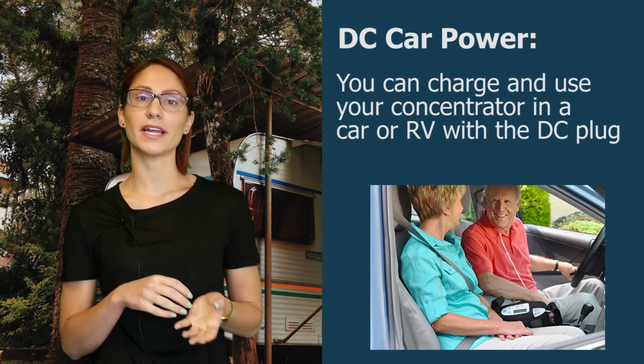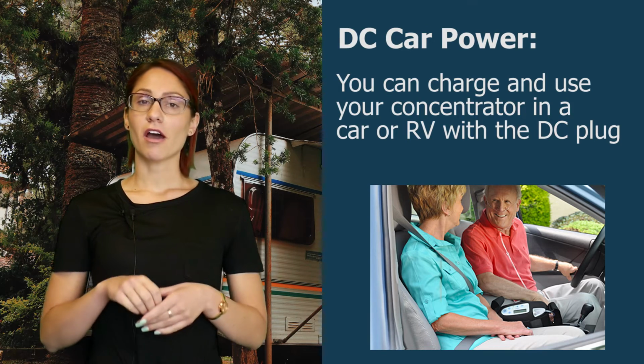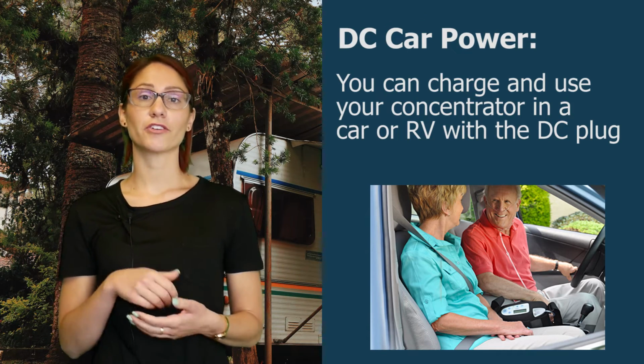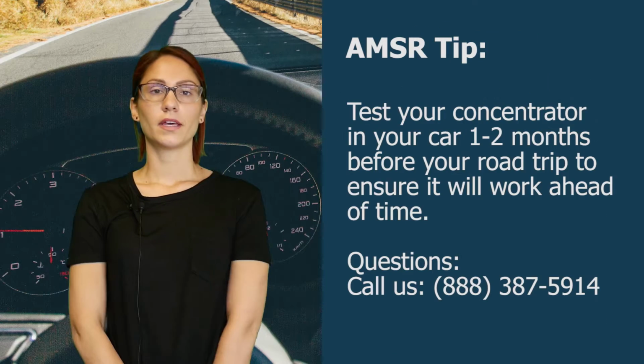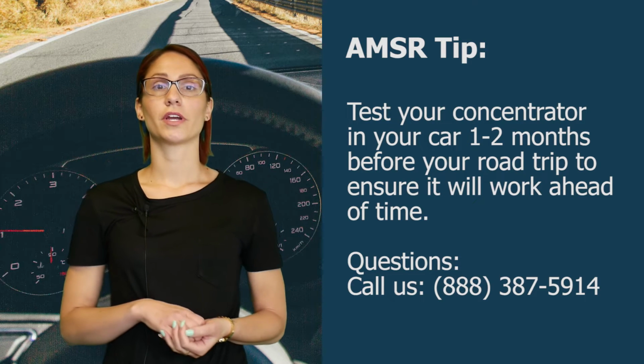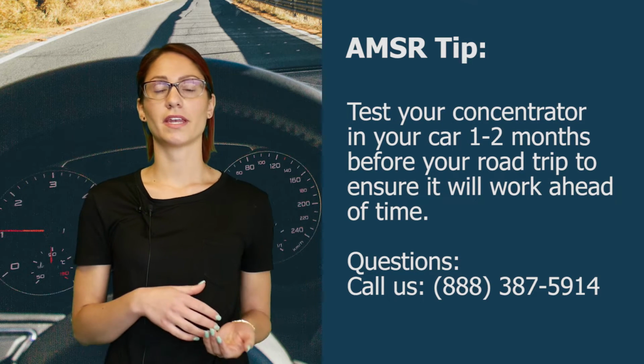Portable oxygen concentrators can work off the DC power in your car. So they all have a plug that connects to the machine and then plugs into the cigarette lighter in your car or RV. We recommend that you try out your portable oxygen concentrator 1 to 2 months before you travel with it in the car.